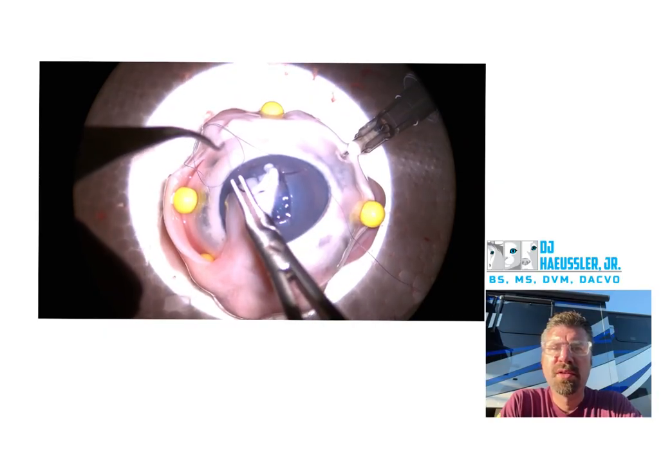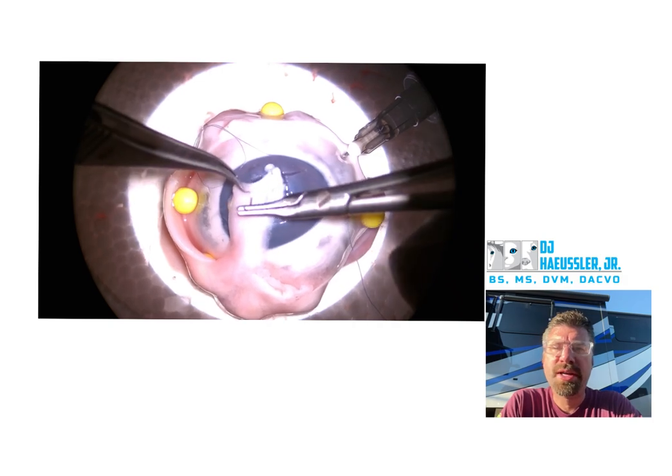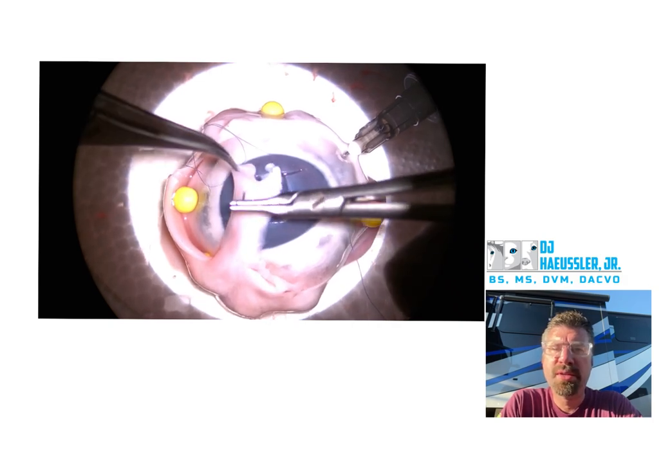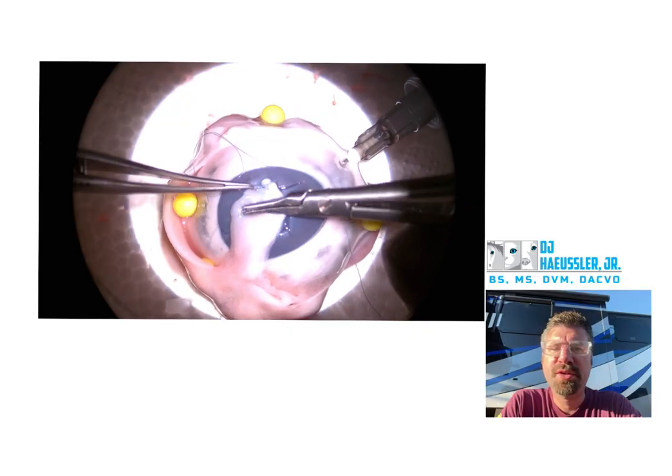Flip your Colibris over. Over — they're upside down. They are still upside down right here. Now you flipped them over, so go ahead.